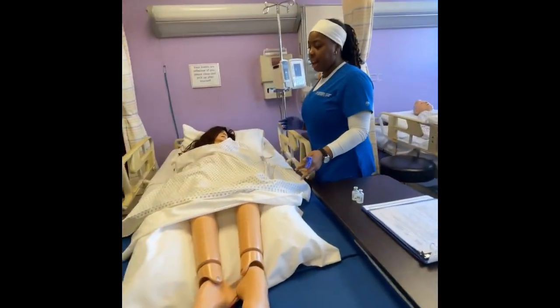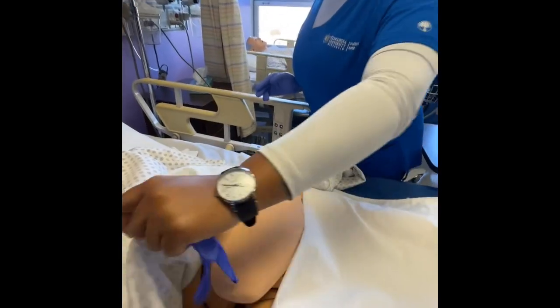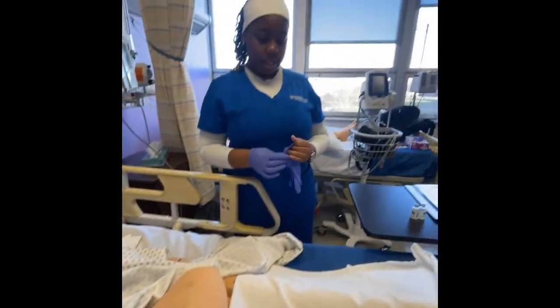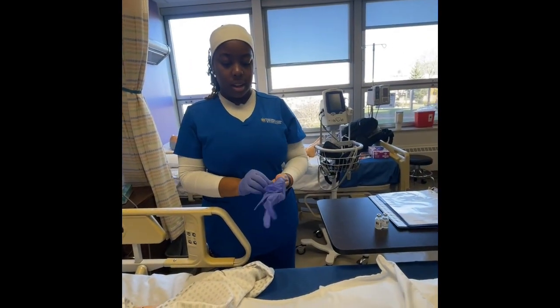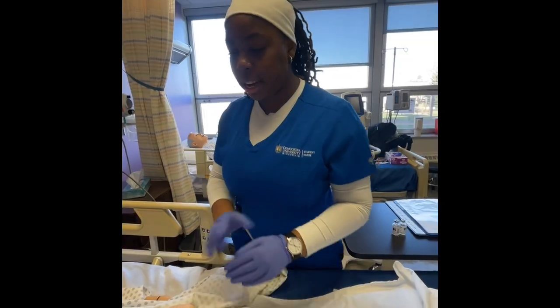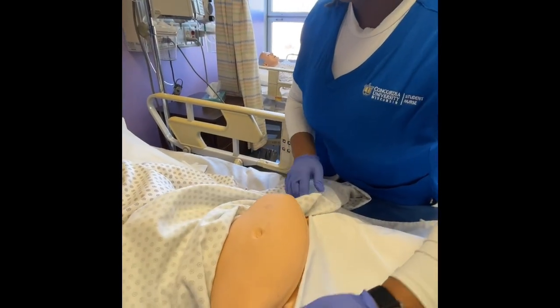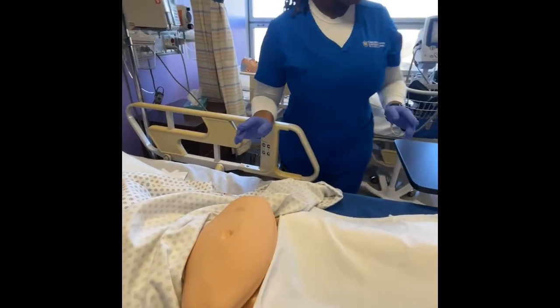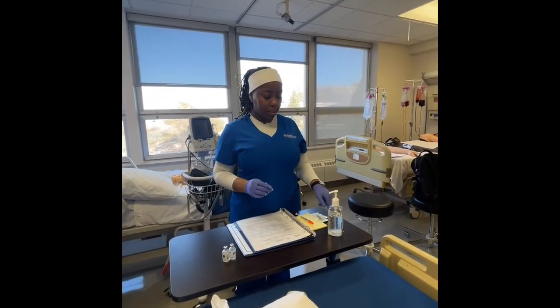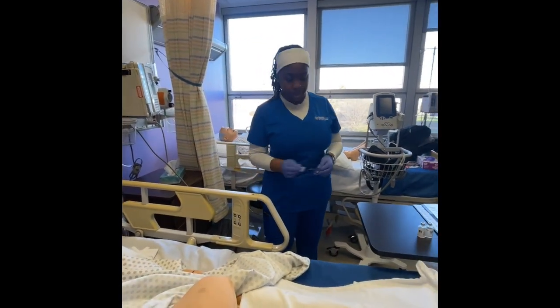And then as I lift her gown, because we're going to be administering on her stomach, you want to make sure her lower half is still covered, giving her privacy. And then putting my gloves on, I am assessing the site first for any redness, scar tissue, lesions, bruises, things like that. Based on where they placed the insulin last time in her stomach, you would actually want to rotate that site. So place it somewhere else.